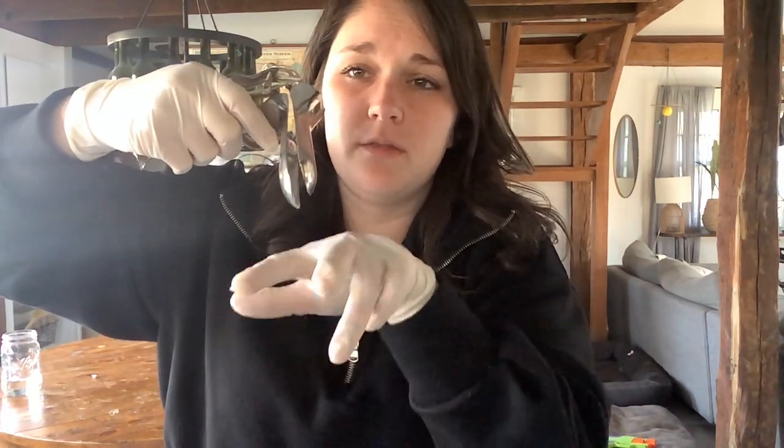Also putting pressure on the vaginal wall just to make sure that I'm not pinching any of the skin, and that I'm not pulling this out quickly, and I'm not pulling this out open. So that would be it for our speculum today.